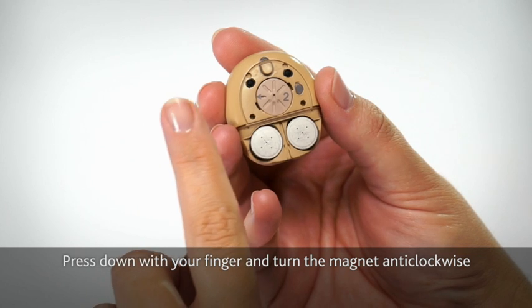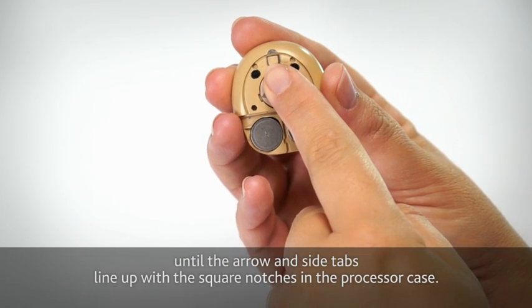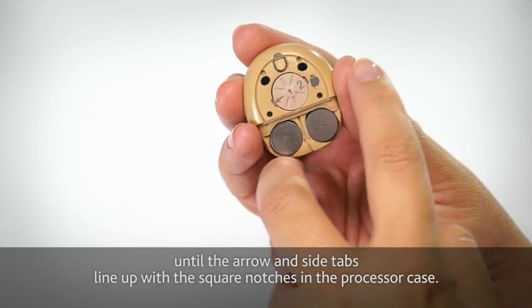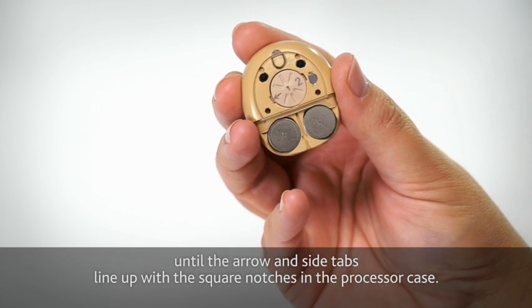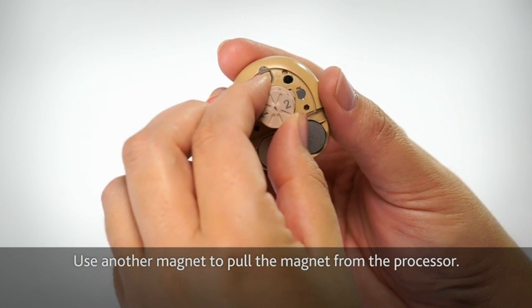Press down with your finger and turn the magnet anti-clockwise until the arrow and side tabs line up with the square notches in the processor case. Use another magnet to pull the magnet from the processor.